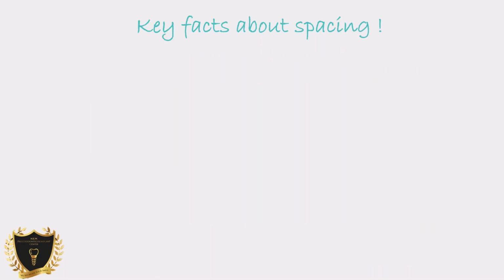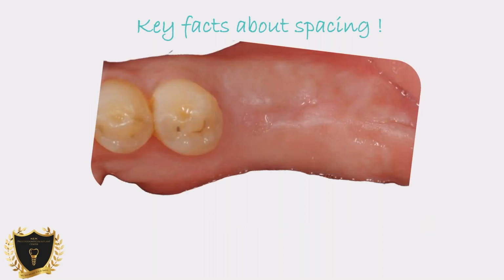In this slide, I will try to put a lot of things together. A lot of times when I'm giving this lecture, dentists will ask, okay, what about spacing? What do we do? We talked about tooth spacing. Let's talk about implant spacing, like a surgical consideration right now. We already talked about mesiodistal, occlusal, gingival dimensions. For example, here we are looking at a case where 28, 29, 30, and 31 are missing. So where do we place an implant?